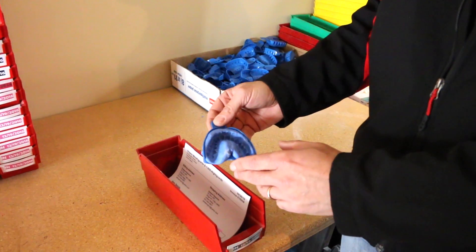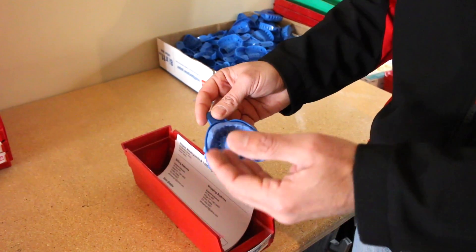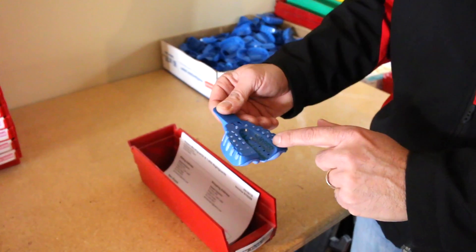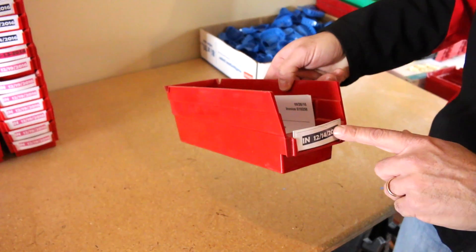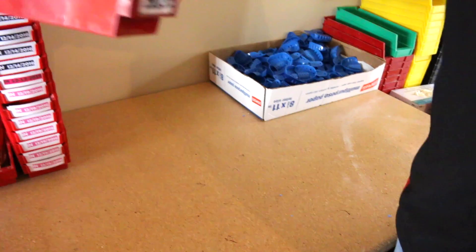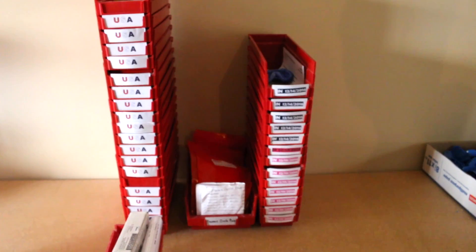Once your kit and impression is checked in in our computer system, we're going to take that impression, disinfect it, and then label it with your order number and your name. It then goes into a color-coordinated tray. The date is put on it so that we know what day it came in and what day it's going back out. And we stack them up here, ready and waiting to get poured.